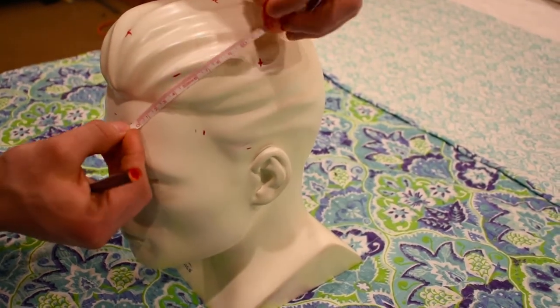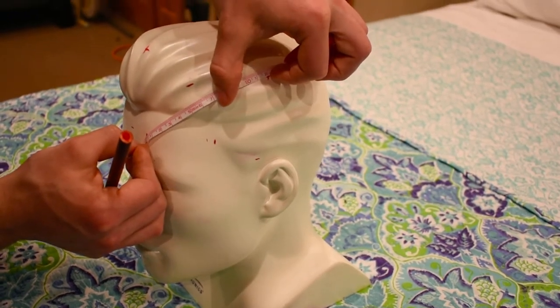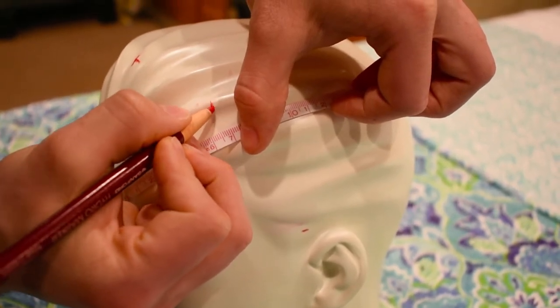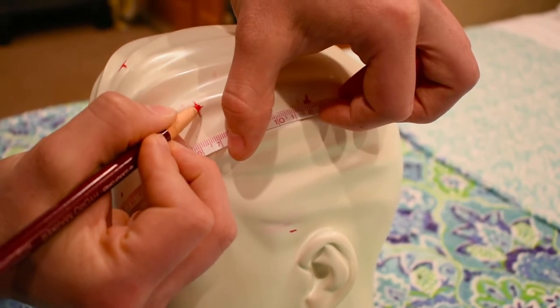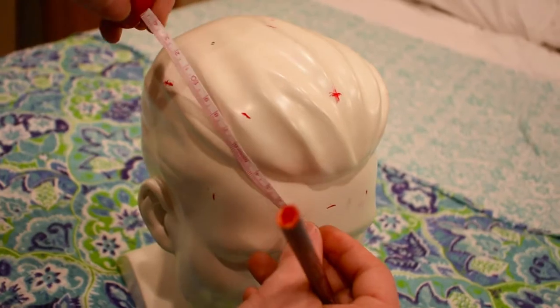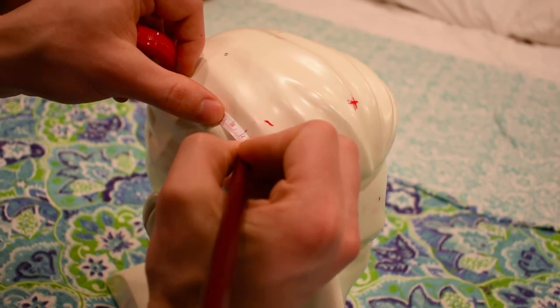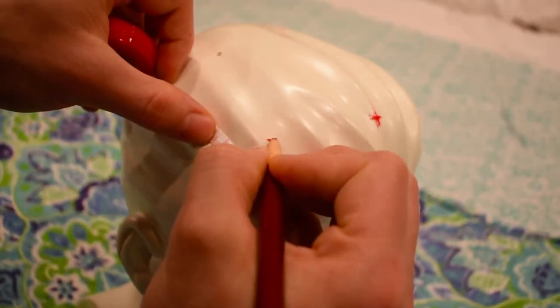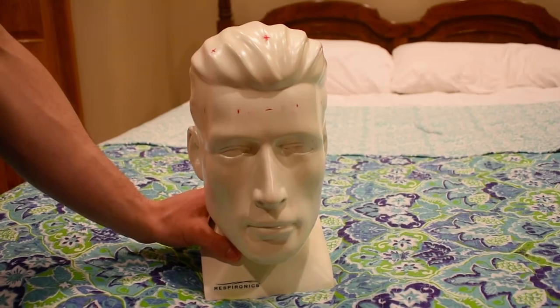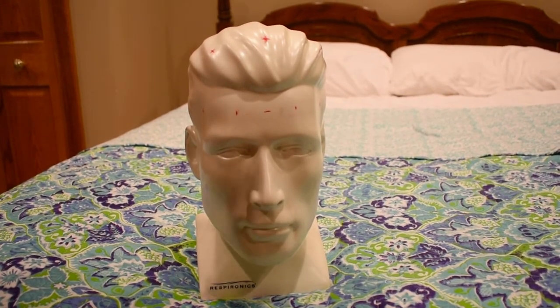And that's going to give us our final crossing mark for our F's. So right there is going to be our mark for F3, and we're going to do the same thing on the other side. 6.5 up. Alright, so that about summarizes the 10-20 system for polysomnography hookup.